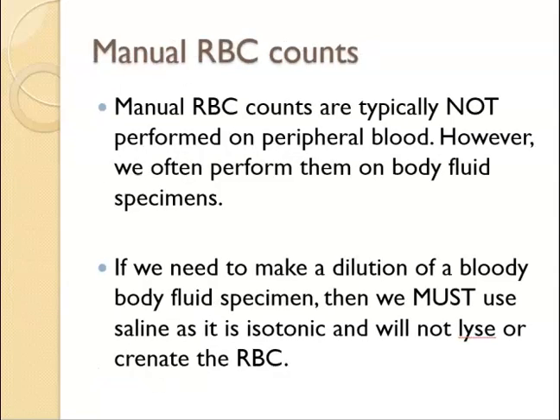So we just talked about white blood cell counts, but let's talk about red blood cell counts on our hemocytometers. When we're performing manual red blood cell counts, we typically do not do those on peripheral blood just because there's so many red blood cells to count. Usually we do that on an automated analyzer, but however we do perform red blood cell counts on body fluid specimens a lot of times manually.